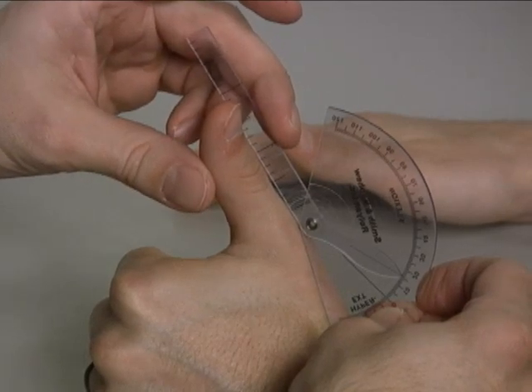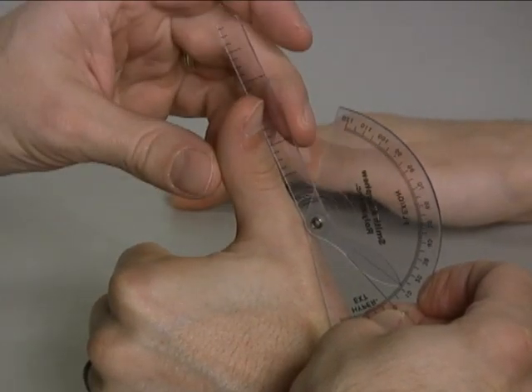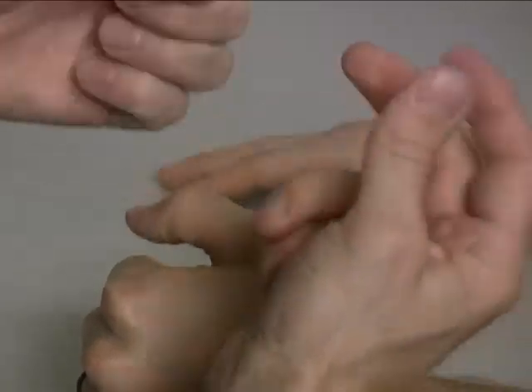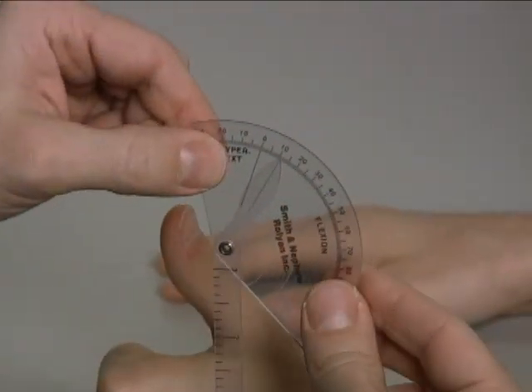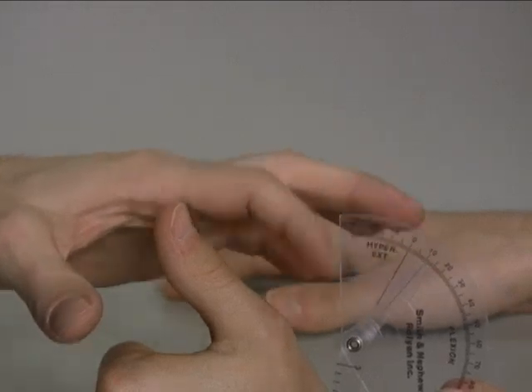We have about minus 10 degrees of extension at the MP joint.